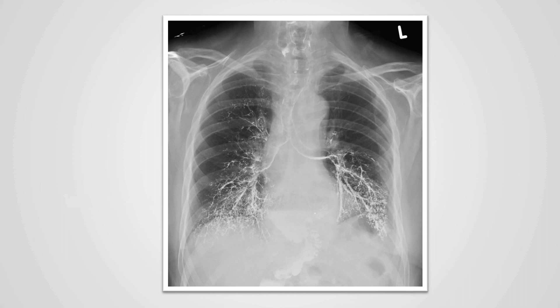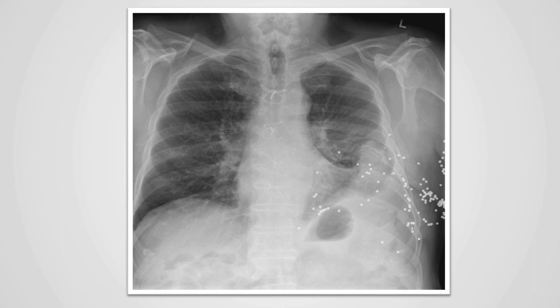In addition though, we can also identify very white density within the trachea and the airways within the lungs. And this happens to be barium that the patient aspirated during an upper gastrointestinal examination.